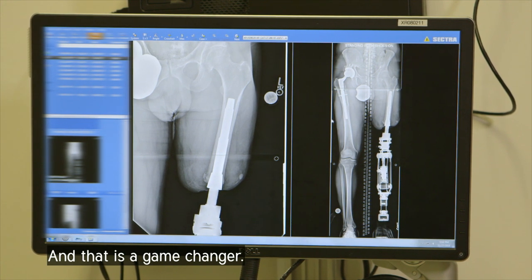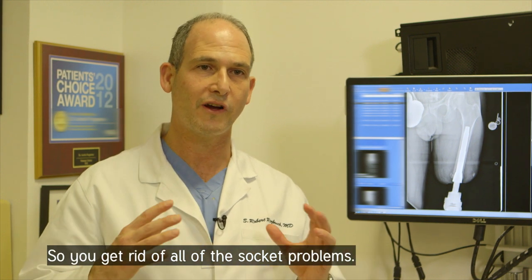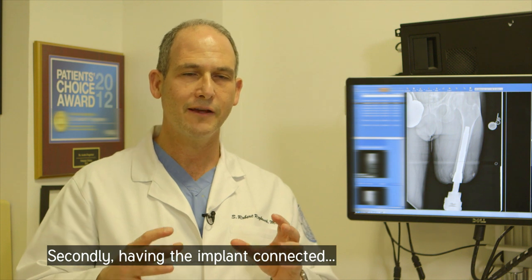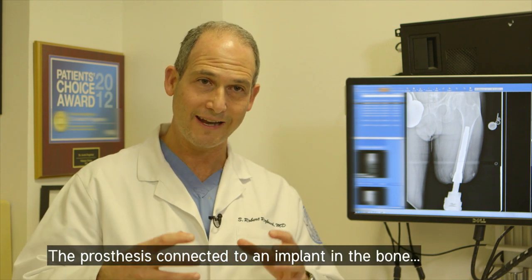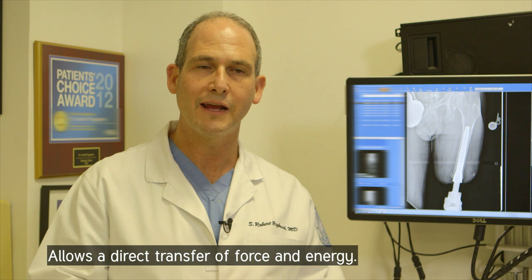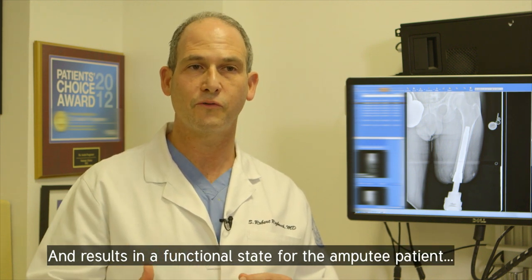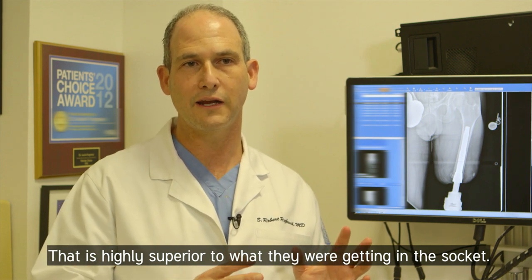And that is a game changer. First of all, there's no socket, so you get rid of all of the socket problems. Secondly, having the implant connected — the prosthesis connected to an implant in the bone — allows a direct transfer of force and energy, and results in a functional state for the amputee patient that is highly superior to what they were getting in the socket.